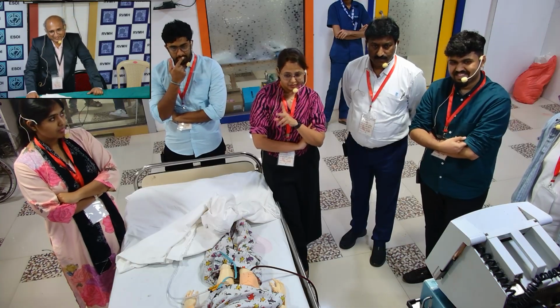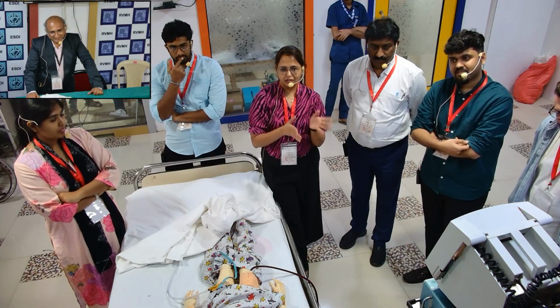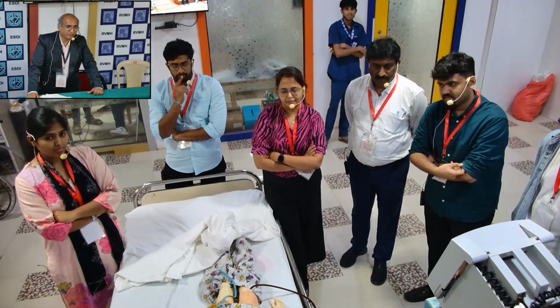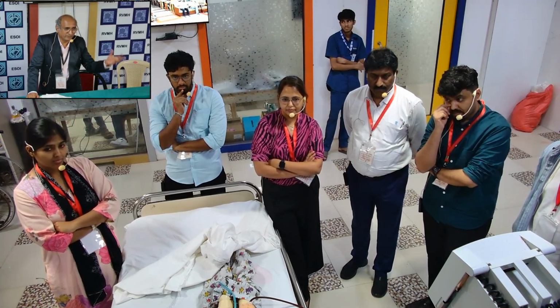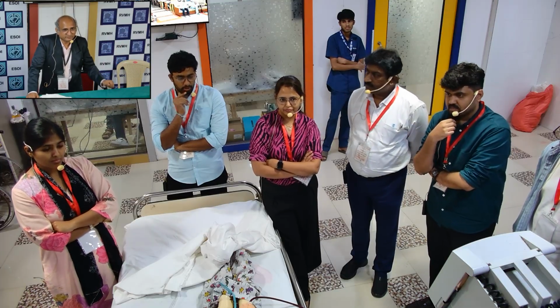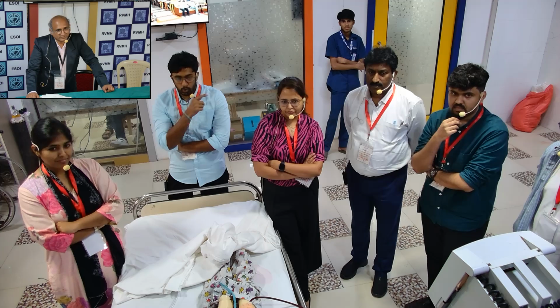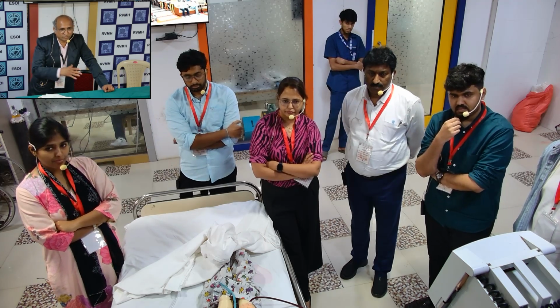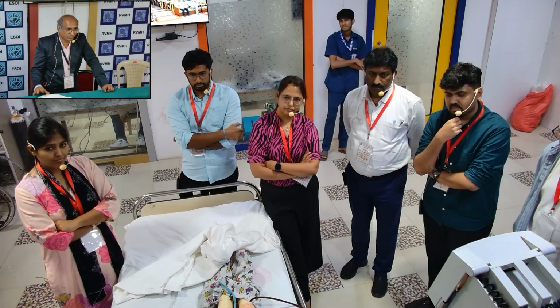Another thing, whenever you are differentiating, first differentiate whether the problem is with ECMO or with the ventilator and separate the two entities. So first find out whether the problem is with ECMO or the ventilator. If the problem is with ECMO, go up on the ventilator. Role allocation. You should divide yourself, whenever you get some troubleshooting, into two teams and allocate the role to everyone.